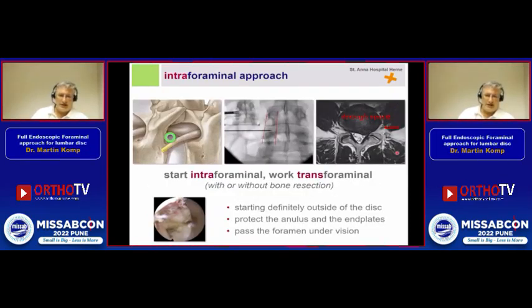When we have done an intraforaminal approach, we then have the possibility to work transforaminally. That means, with or without bone resection, we start definitively outside of the disc. We protect the annulus and the end plates, and then we pass the foramen under visual control.